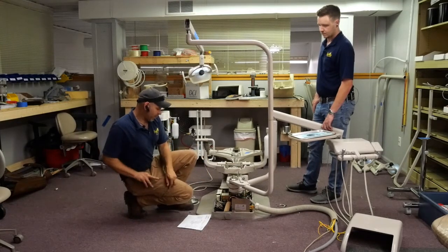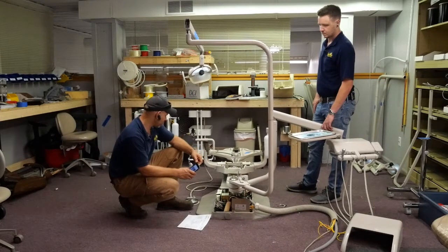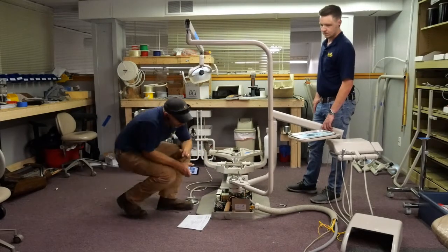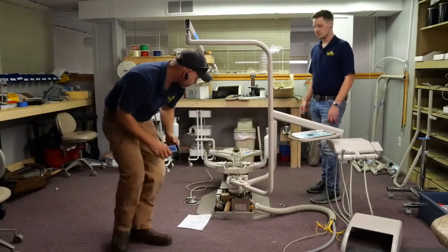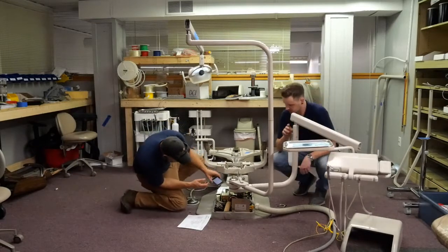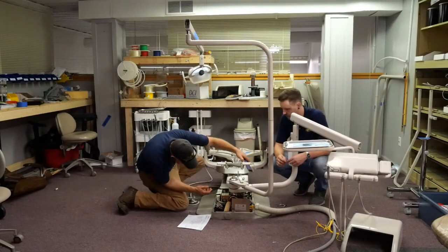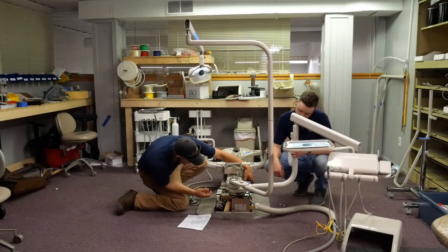What you'll see is if you shine a flashlight, and at this point, for safety, we can unplug the dental chair. By shining a light behind the reservoir, you can actually see the level of the reservoir. About an inch down. About an inch down, okay.